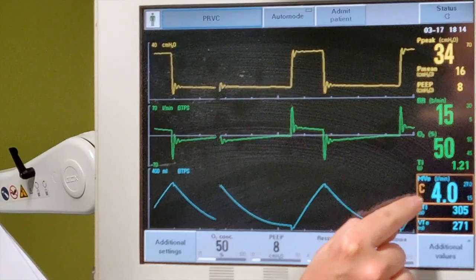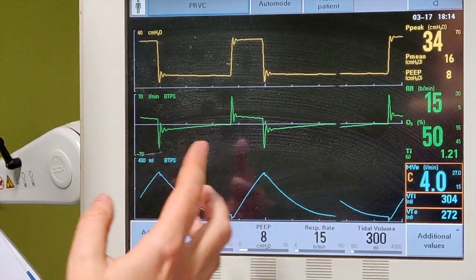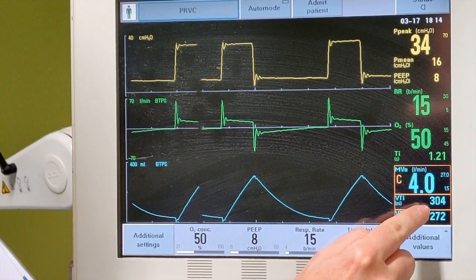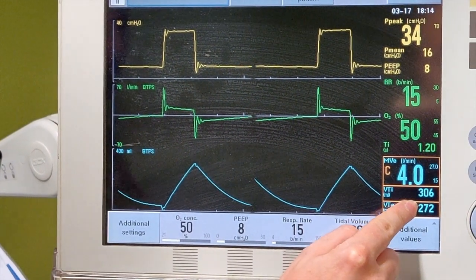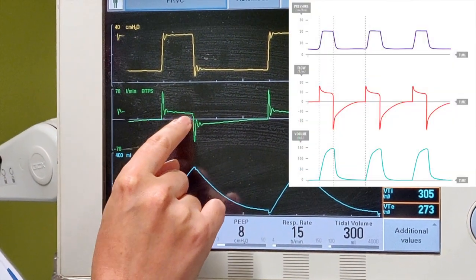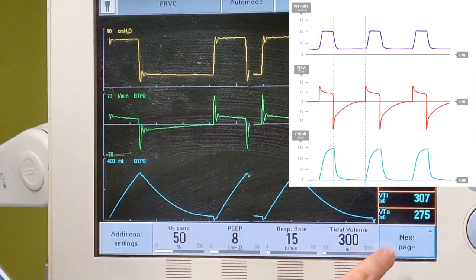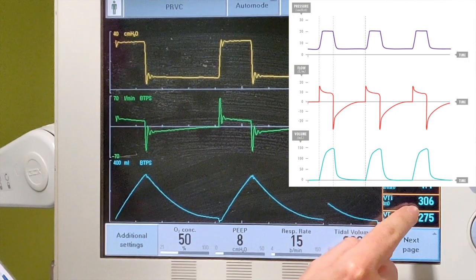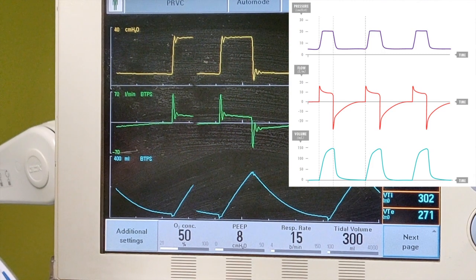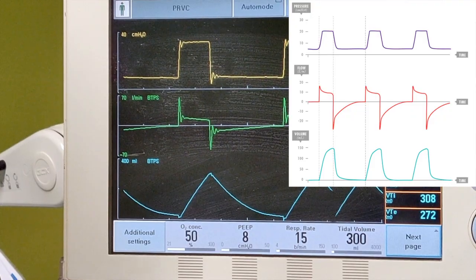So what's going to happen is the ventilator is going to deliver this 300 on the pressure. These 300 are going to come back, but a lot of it is going to remain only in the dead space and will not participate in gas exchange. So if you have particularly obstructive patients where you can see this is not reaching 0, don't be reassured by the volumes you're setting up and achieving here, because this might not be true. If you then find the patient is hypoventilated, do not be surprised. In these cases, you might need to go up in the target volumes to achieve the same result.